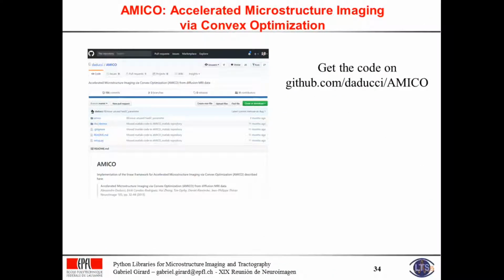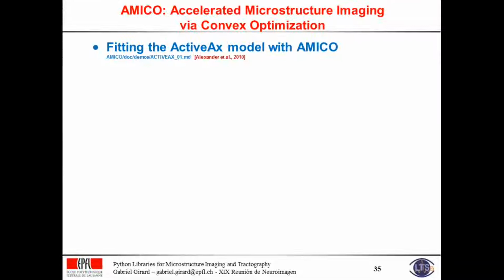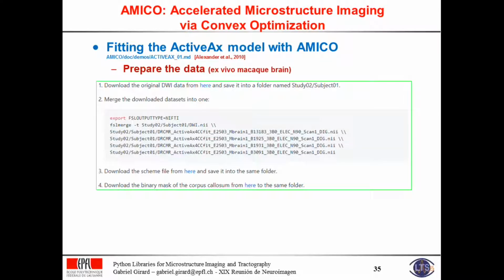Again, everything is on GitHub, very easy to install if you follow the simple installation steps. So we'll go through two examples. The two examples are on the website, on the GitHub, so you can do it yourself afterward if you want to get used to it, and then you can swap the example data with your own data and see what you can estimate.